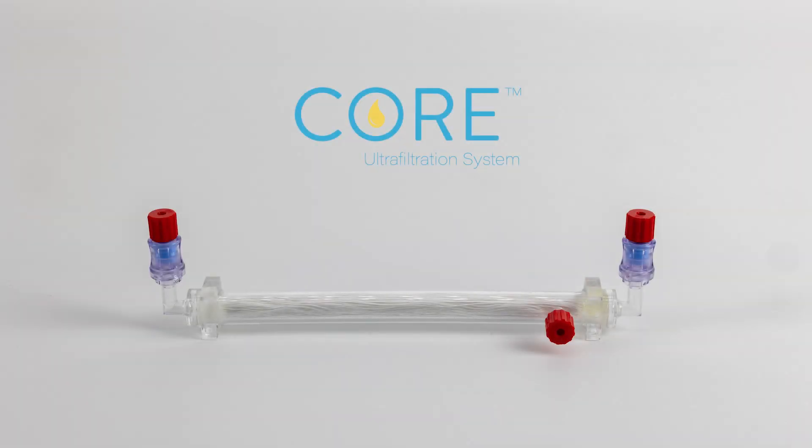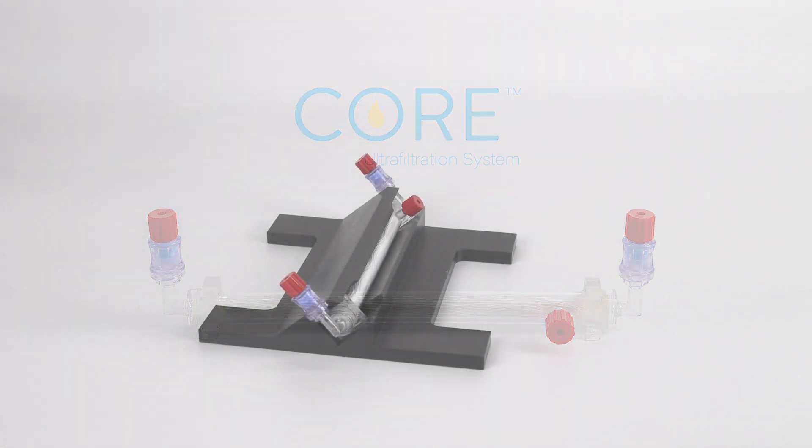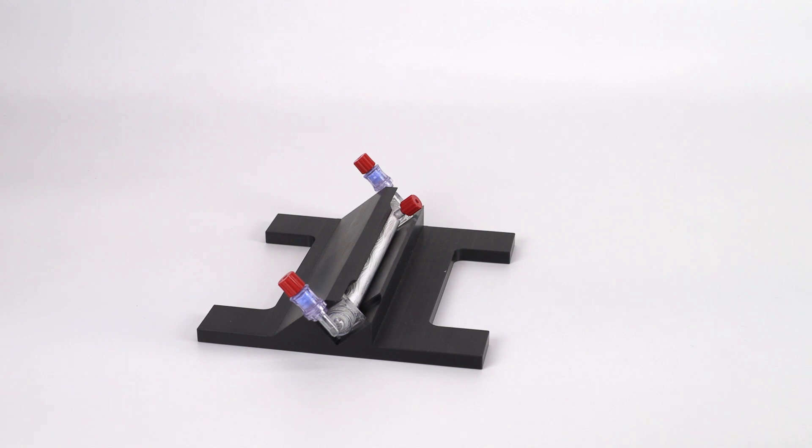The core ultrafiltration system is used to concentrate the proteins in the plasma solution. To begin, place the core ultrafiltration device into its processing base. Remove the red vented cap on either end port and attach the hydrophobic filter.